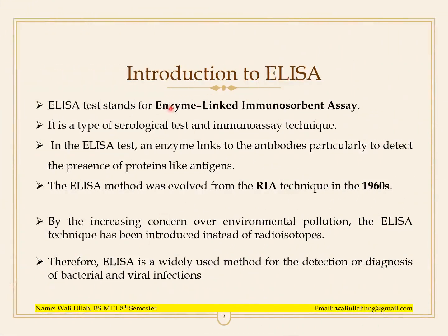Introduction to ELISA. ELISA test stands for enzyme-linked immunosorbent assay. It is a type of serological test and immunoassay technique. In the ELISA test, an enzyme links to the antibodies, particularly to detect the presence of protein-like antigen.